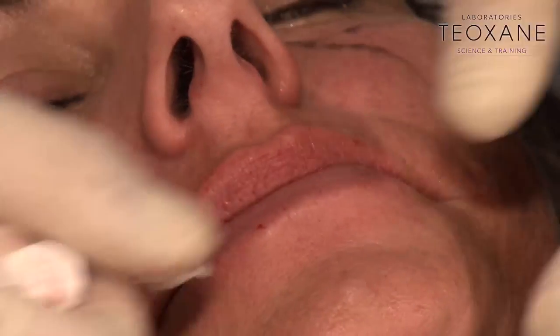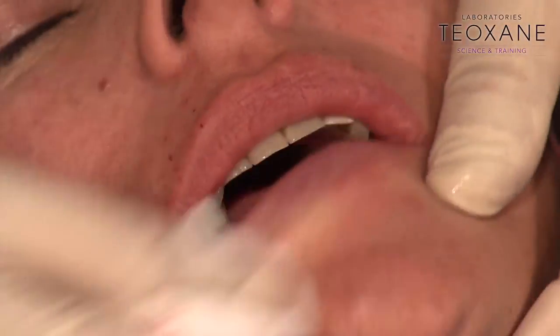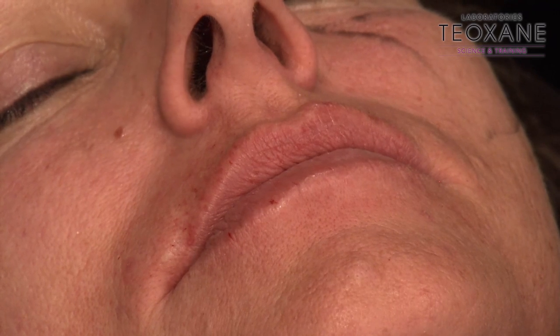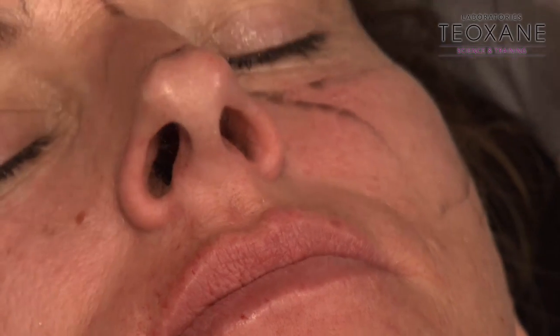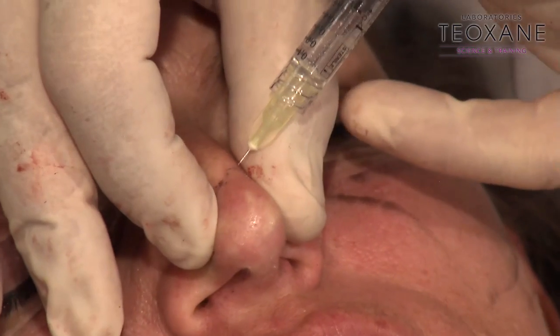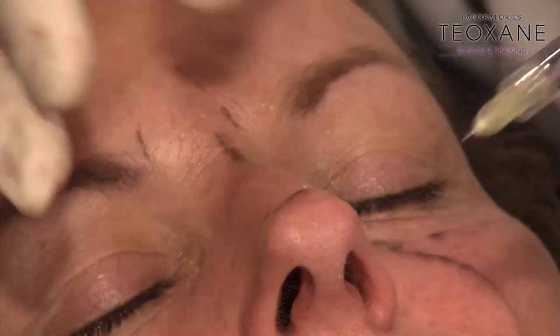I'm going to let this thing settle a little bit. Open the mouth. Okay, I will maybe adjust again. In the meantime, I'm going to do a little bit on the nose just to show you the number 2, RHA2, short needle. As I say, I don't think it's the proper indication because she has an excess of alar cartilage, so she needs reduction more than filler, but she still has a little dent on top. I'm going to try to smooth the whole thing. You see? I can smooth, so it looks less irregular.